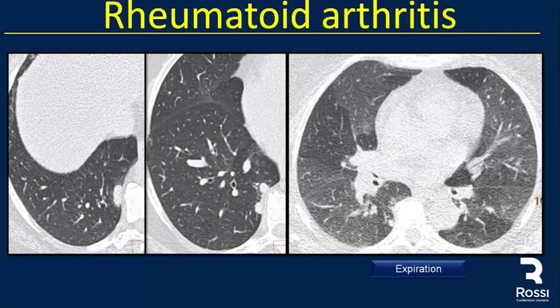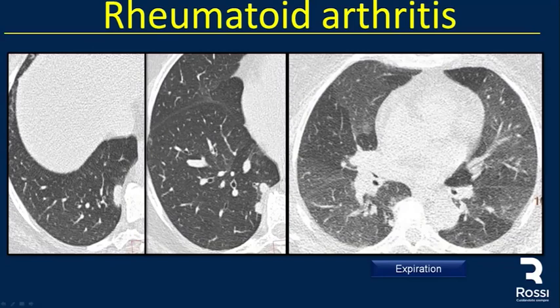Another rheumatoid arthritis case showing two less common findings: subpleural rheumatoid nodules, and on expiratory CT, areas of air trapping with diminished vascularity and areas of normal lung that are more condensed or collapsed, consistent with constrictive bronchiolitis.